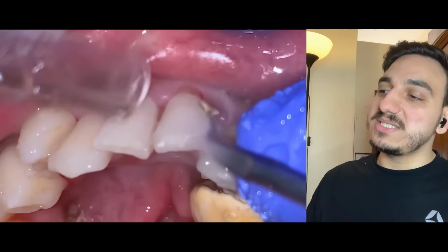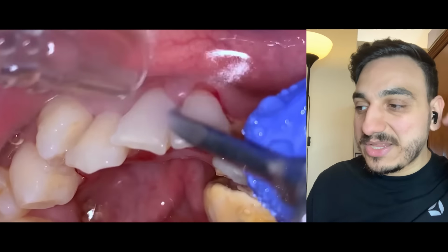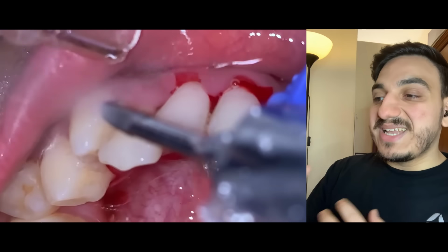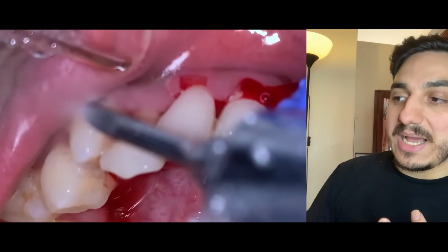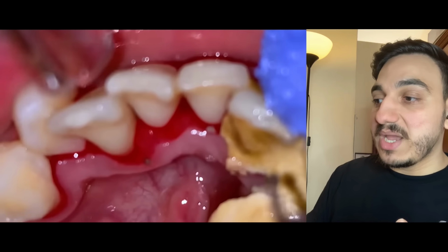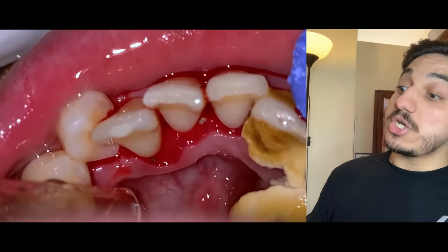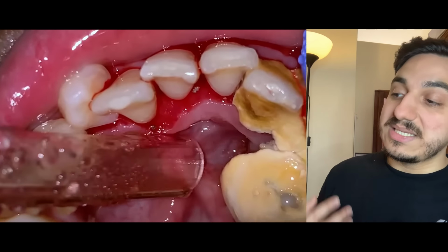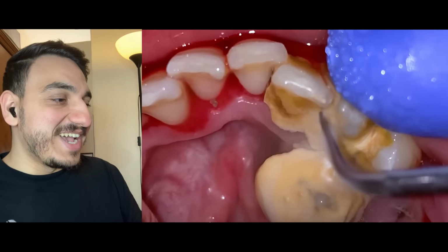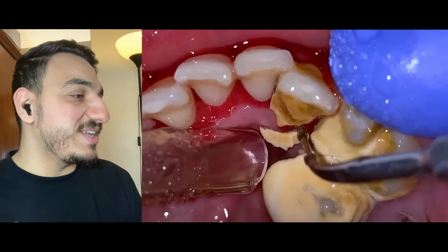Okay, so as you can see, there's a clear pattern that we're seeing: the dental tartar and dental calculus tends to accumulate near the gum region, and that is very evident in this video. But also as the dental tartar gets more extensive, we're going to start with that massive region that is in the thumbnail. So there you go.